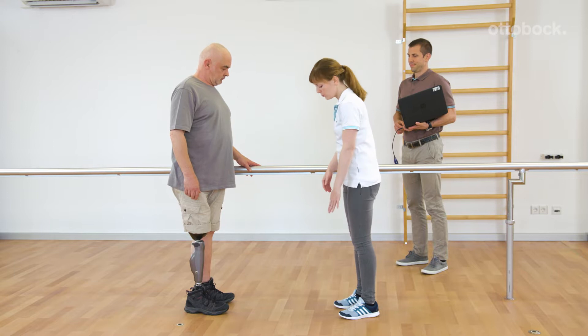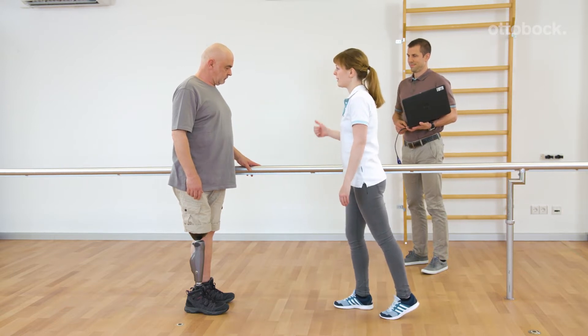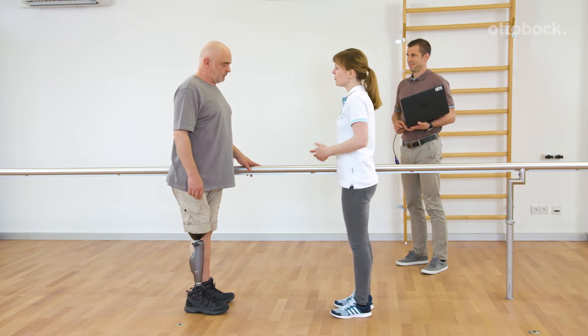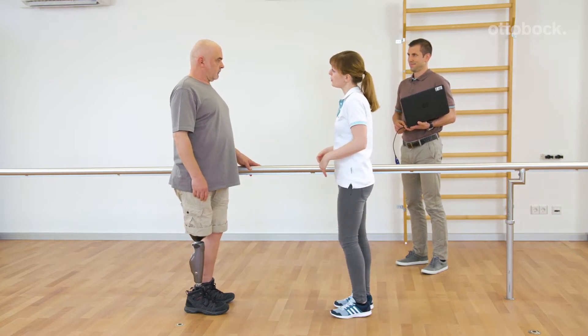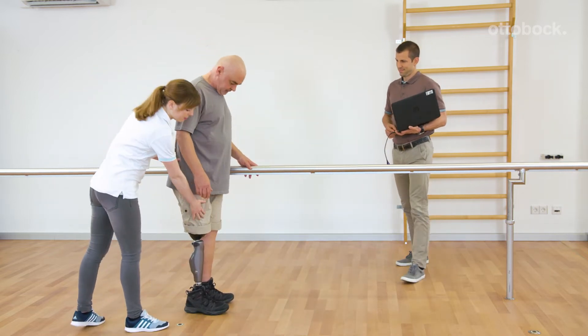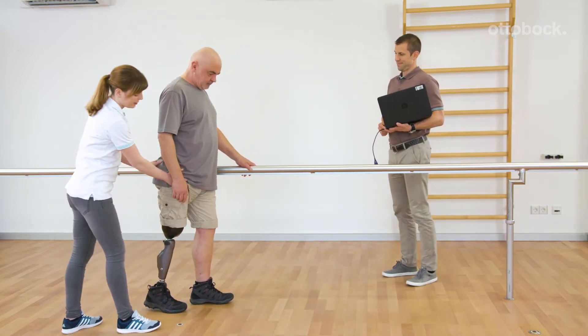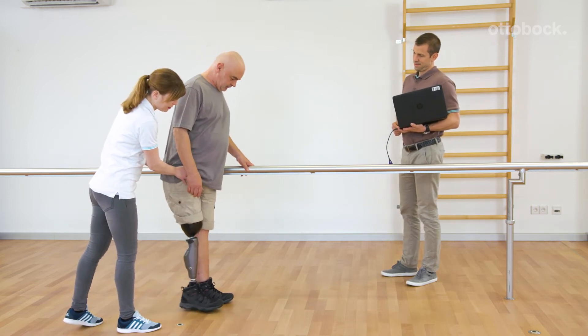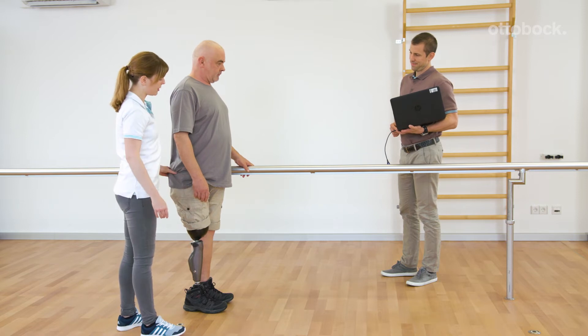Franziska shows how to switch into the MY modes by a motion pattern. This requires fast bouncing on the forefoot, exactly three times for the first MY mode. After a short acoustic signal, the prosthetic foot has to be loaded and placed next to the other foot. Two beeps confirm the switching into the first MY mode.